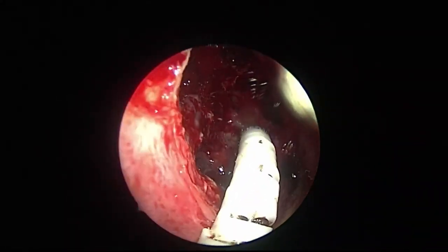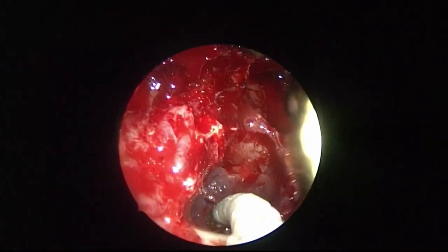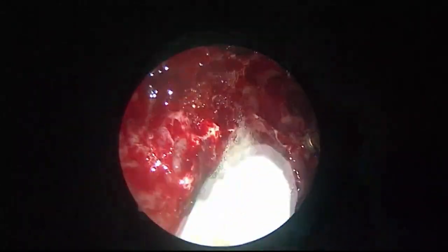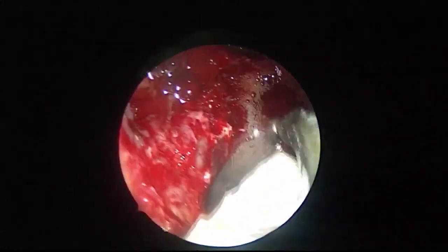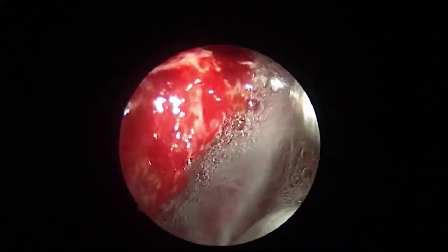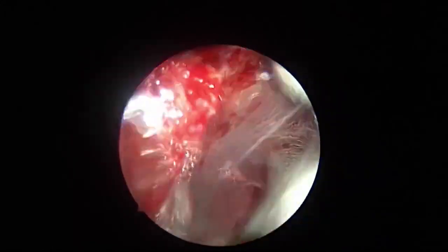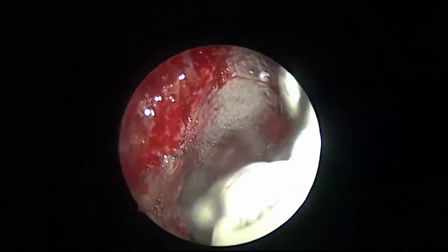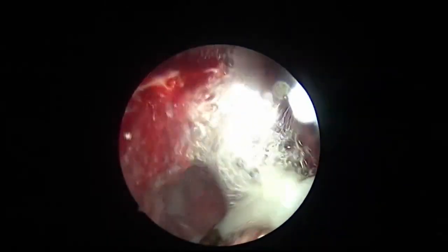Now I am rotating. Rotating. See this? Rotating more. This is 360-degree rotatable. See where in the anterior part I am flushing. Yes, can you see? Yes, we can see that. It cannot leave behind anything.